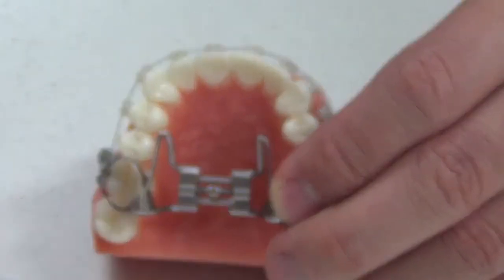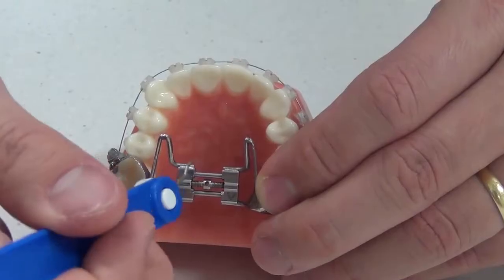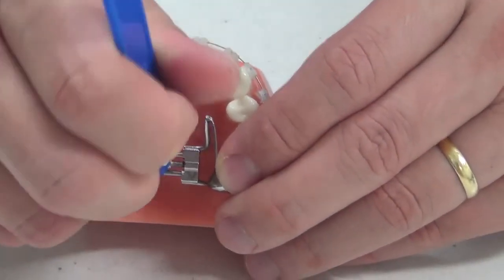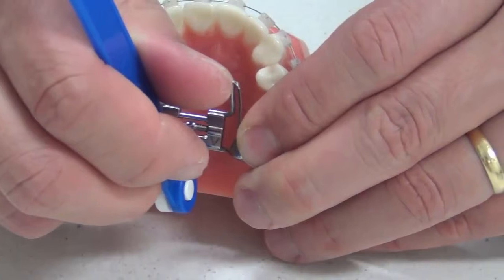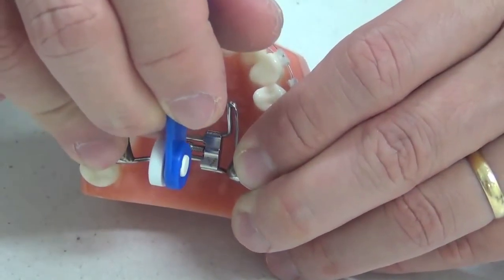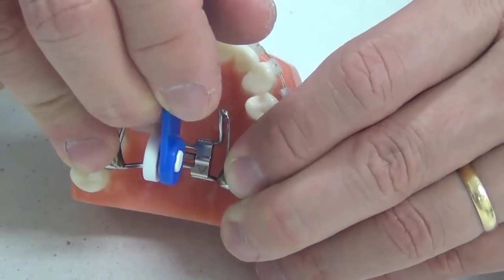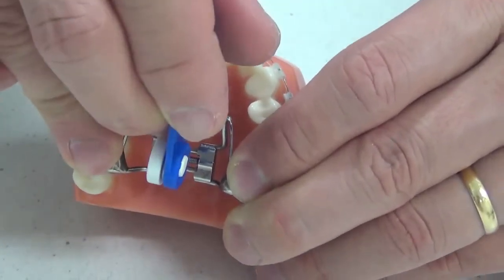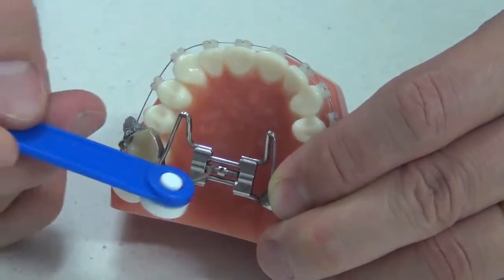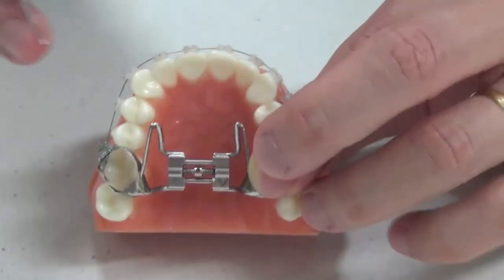The second most common mistake is when the key is in and turned one full hole revolution, but then your son or daughter closes their mouth. In order to take the key out, you wind it back, and now you've got a similar problem — the hole is no longer visible from the front of the mouth and it becomes very hard to reinsert the key.